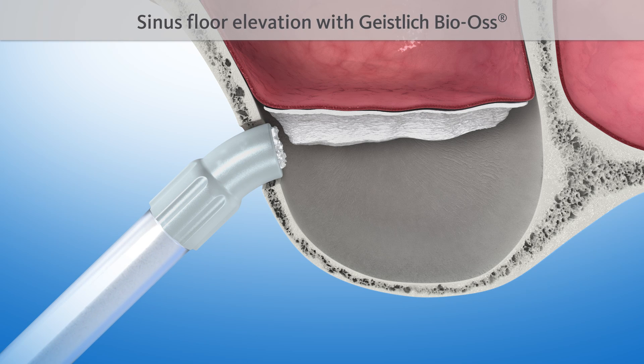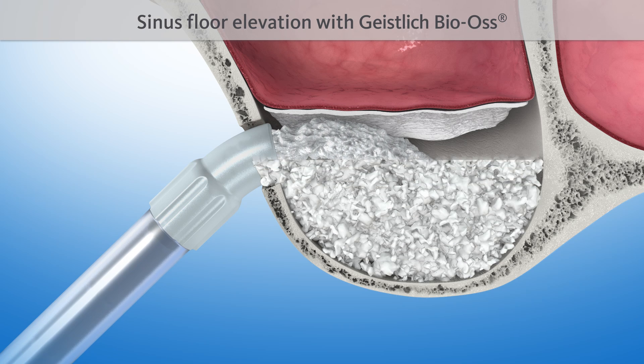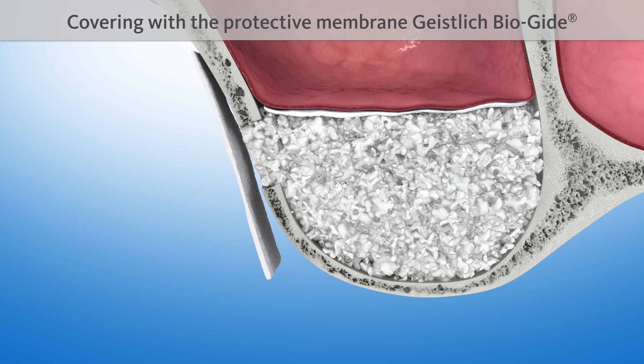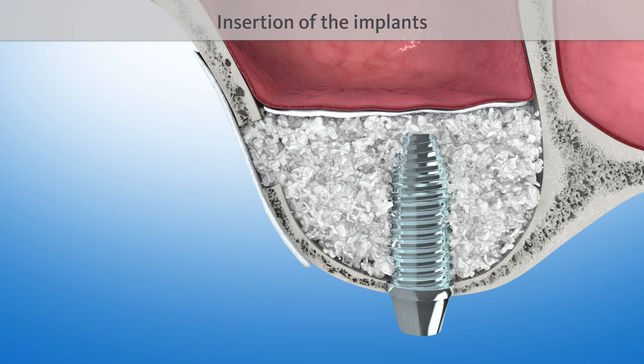The sinus floor is then elevated with a proven bone substitute material, such as Geistlich Bio-Oss. The lateral opening is covered with another protective Geistlich Bio-Gide membrane. Finally, one or several implants are inserted.